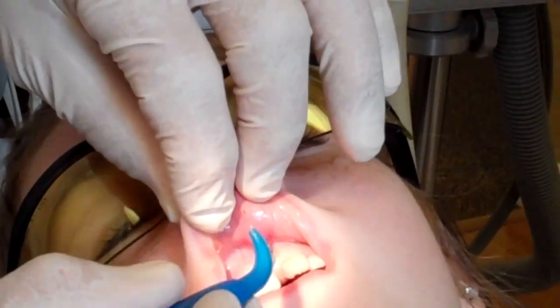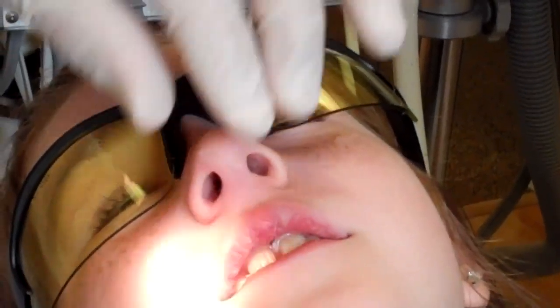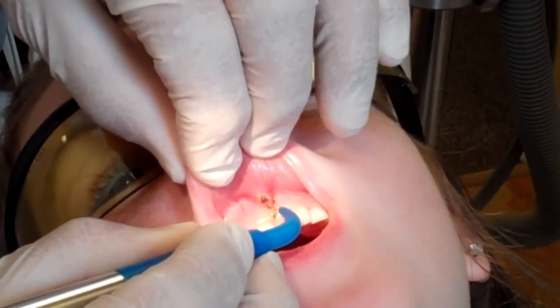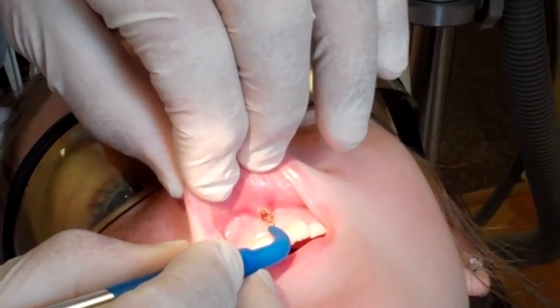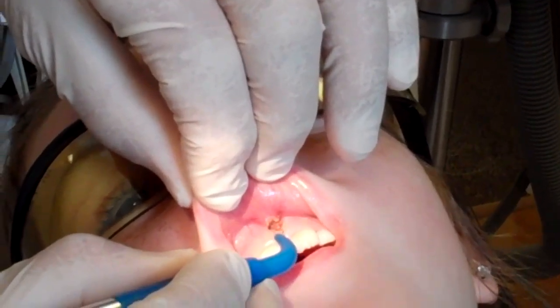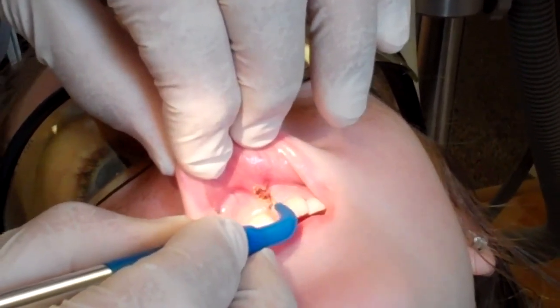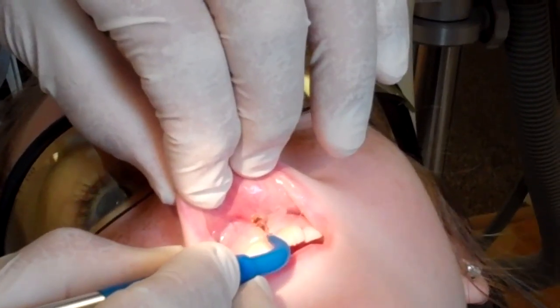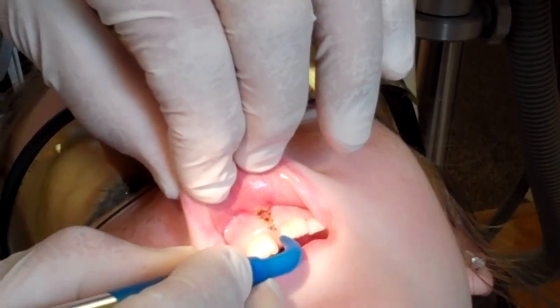So we're just about done. How are you doing? Good, all right, great — she's amazing, it's going very well. So we're just going to do a little bit more here, just going to zap that off — that little noogie right there. And we'll just clean this up for just a little bit more.